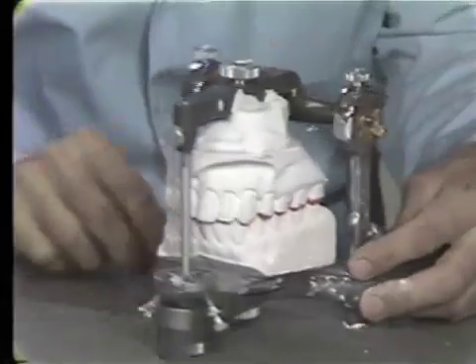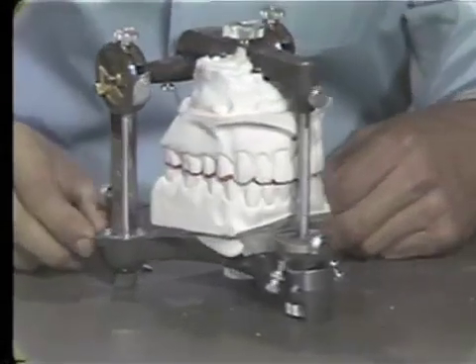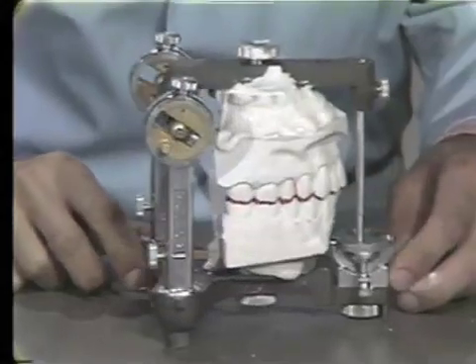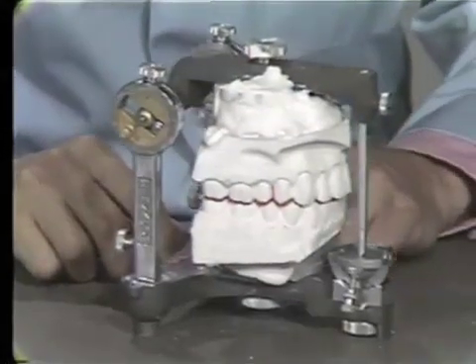So now we'll let this plaster mix set up, and when we come back, we'll show you the way that the model should be moved and set.